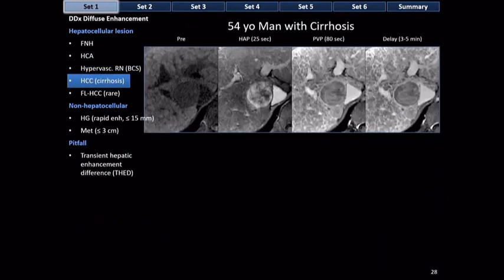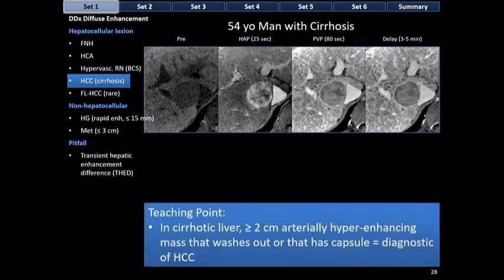In cirrhosis, there is early HCC which often does not hyperenhance, and progressed HCC which has pushing or expansile growth, arterial phase hyperenhancement, washout, and capsule appearance. A progressed HCC example: arterial phase diffuse heterogeneous enhancement, washout to darker than background liver in portal venous and delayed phases, and a rim of smooth hyperenhancement corresponding to capsule appearance. Teaching point: in the cirrhotic liver, a mass greater than two centimeters with arterial hyperenhancement that washes out, has a capsule, or both is diagnostic of HCC. Biopsy is not needed to confirm the diagnosis.